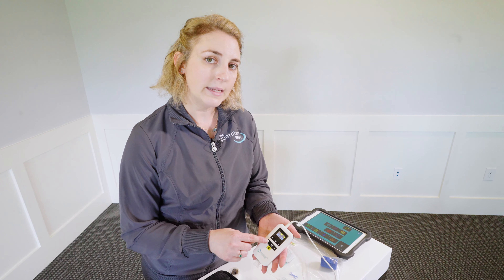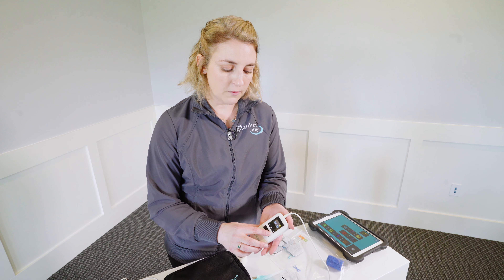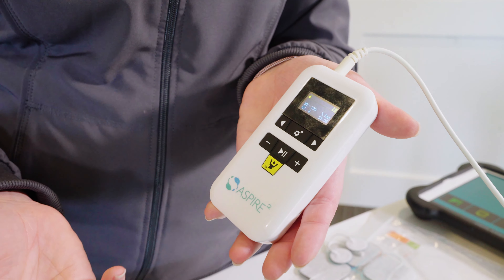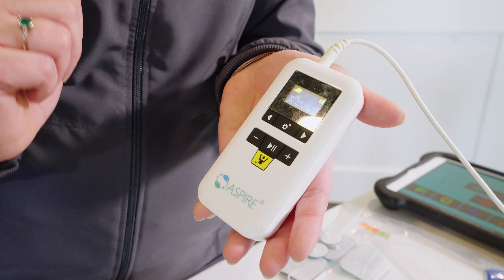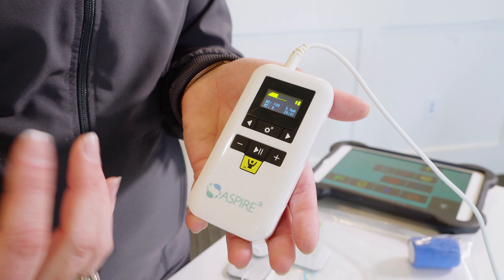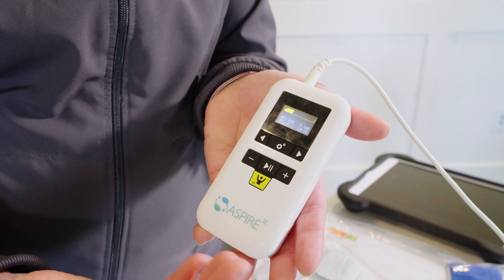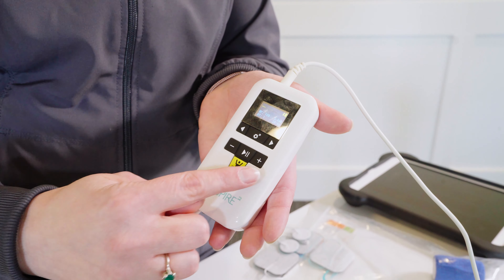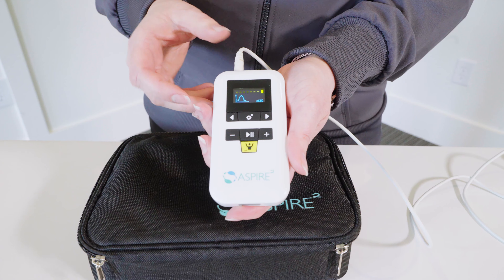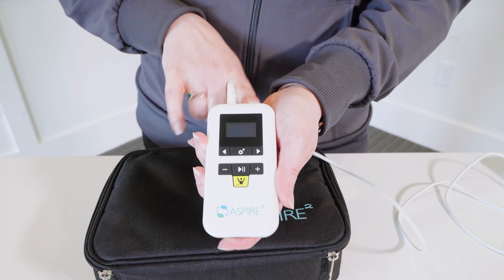There is a safety feature where you need to hit minus-minus and then hit plus to increase the amplitude. This prevents you from accidentally bumping it or from it increasing abruptly. Once you've reached where you need to be, you'll see it displayed on the screen. If at any time during treatment you need to go down, simply hit minus; to increase, hit minus-minus then plus. To power the device down, just hold down the gray button on the top until the screen goes blank.